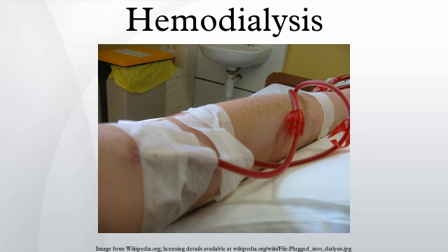Assess the central venous catheter for tip placement, exit site and complications. Document and notify the appropriate healthcare provider regarding any concerns. Educate the patient on appropriate cleaning of the fistula, graft and exit site, with recognizing and reporting signs and symptoms of infection and complication.